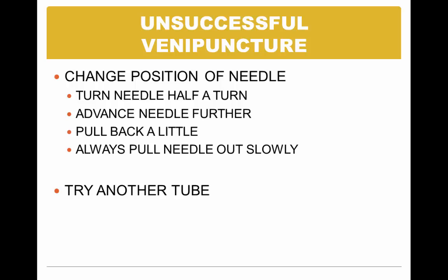Now, if you're not successful, you see your flash or your little bit of blood, the tube itself may not have enough vacuum in it, so you may have to try another tube.